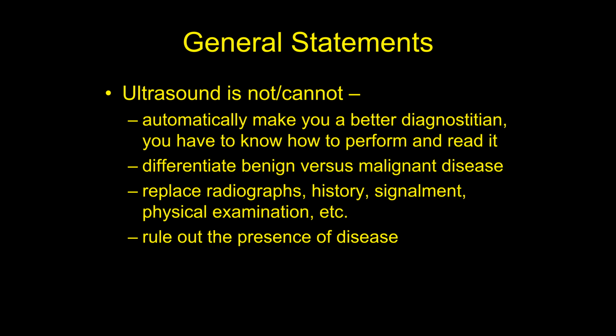Okay, what can ultrasound do the opposite? What does it not do for you? Just because you go buy an ultrasound machine, you have to learn how to use it. And that's where unfortunately, a lot of clinicians fail. They'll go buy a nice $30,000 ultrasound machine, but they use it just to get urine and look for bladder stones. And they fail to make that next step of really learning how to get the information out of that machine and really use it properly.